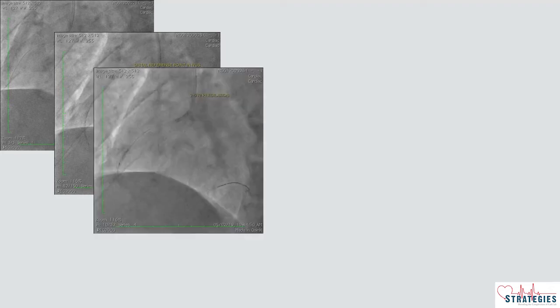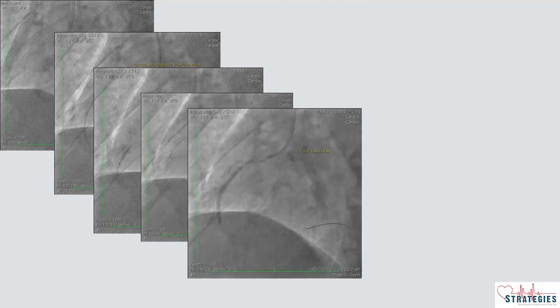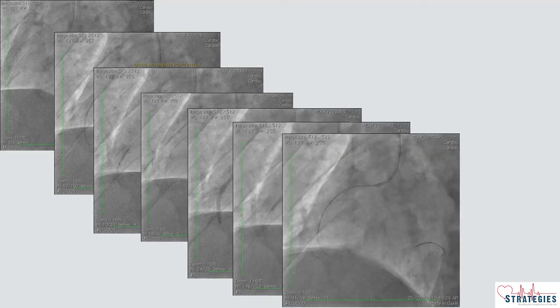So we pre-dilated, right, and then we took another balloon, 2.75 x 32, again pre-dilated the entire lesion, and then did IVUS to understand any change in distal diameter, the distal reference diameter. As I told you already, it changes by a quarter size, so we took a 3.5.